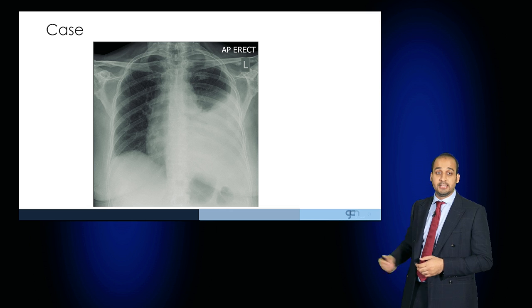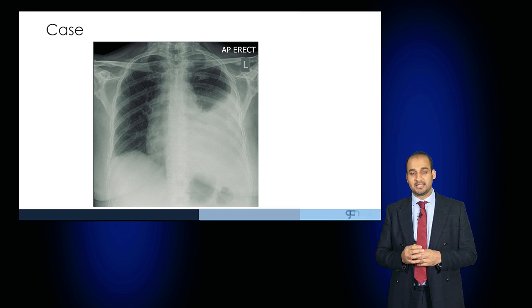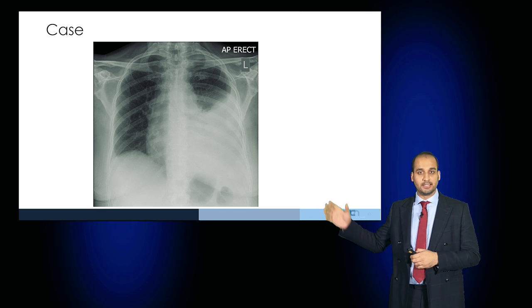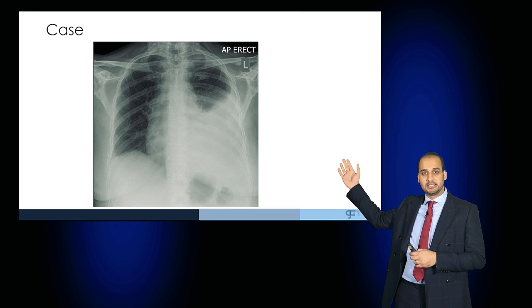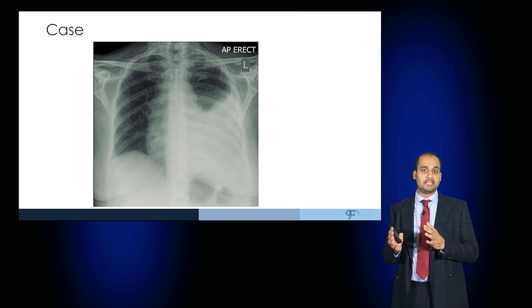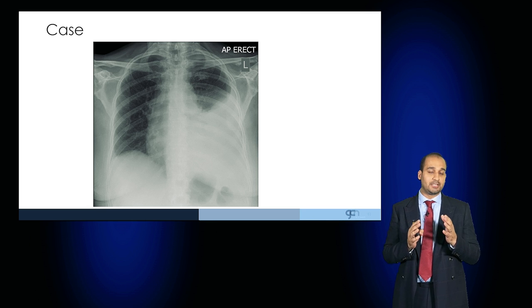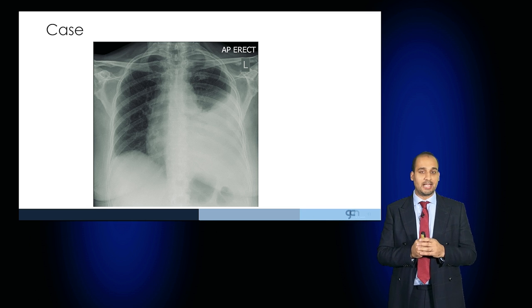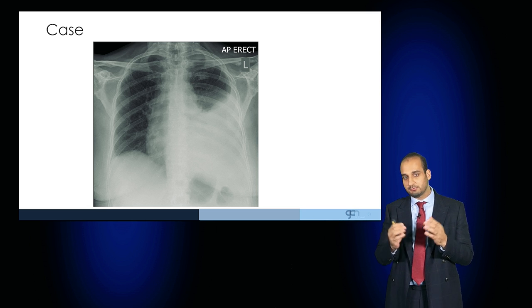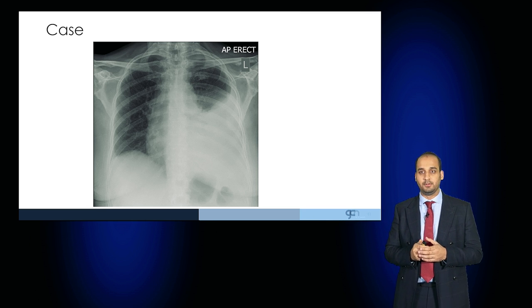Have a look at this case, which is a more advanced effusion. On the left-hand side, you can see the meniscus sign rather high up. And there is some early pushing of the trachea towards the contralateral side, suggestive that there's more than a thousand millilitres of fluid.